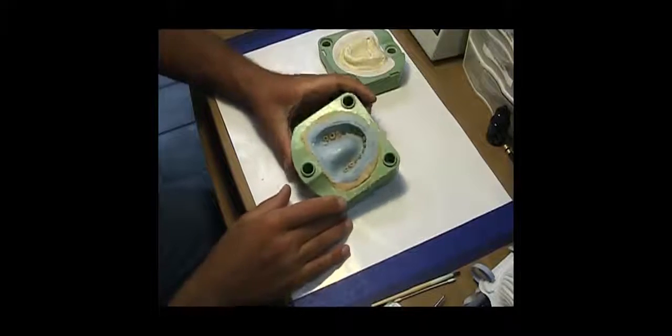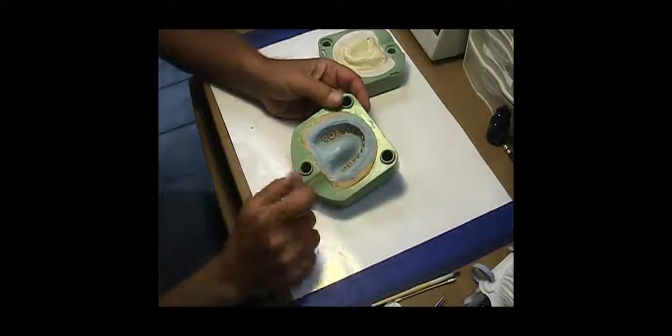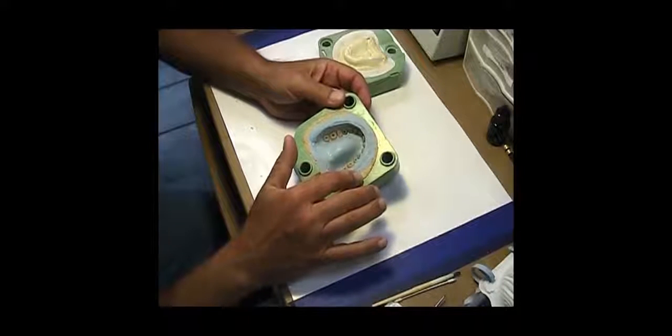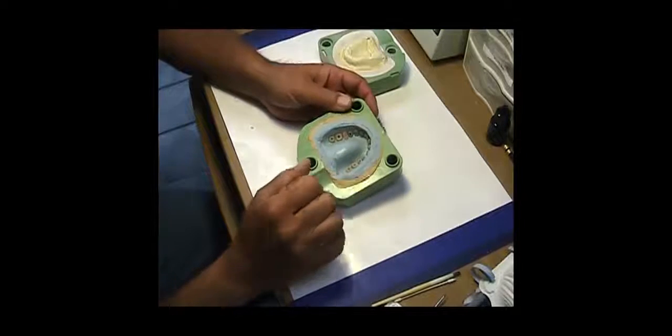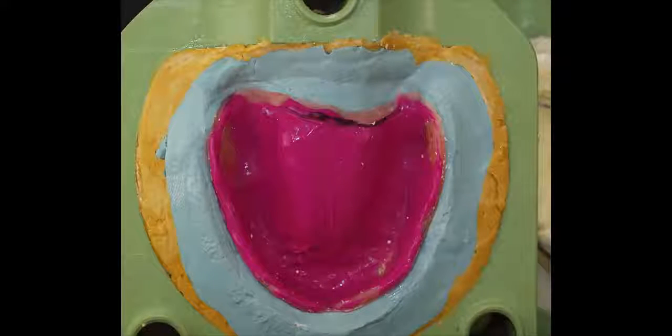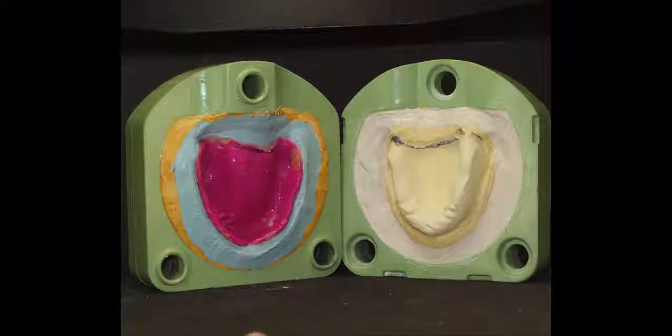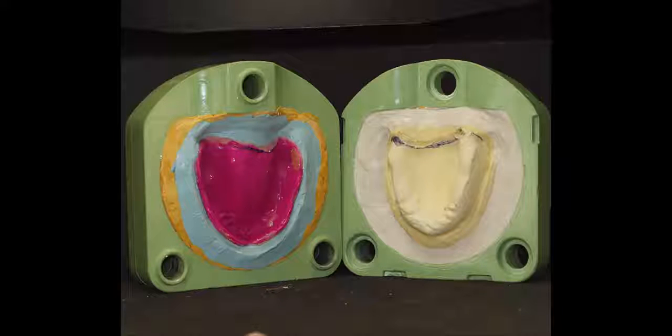This is the GC LT putty. Once I poured the cap onto it, I open up the flask and remove the denture. In this case, the denture had porcelain teeth with the exception of two teeth - a central and a second bicuspid.